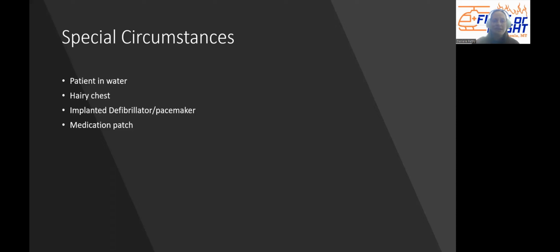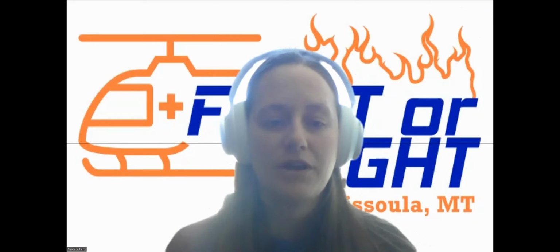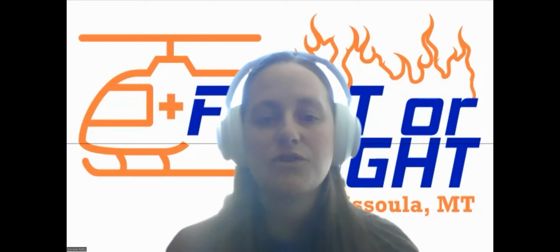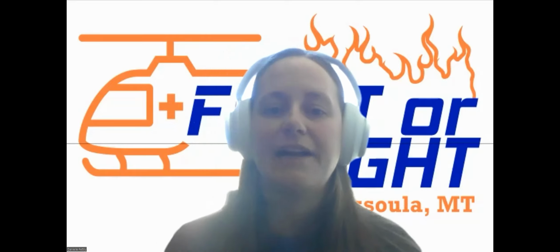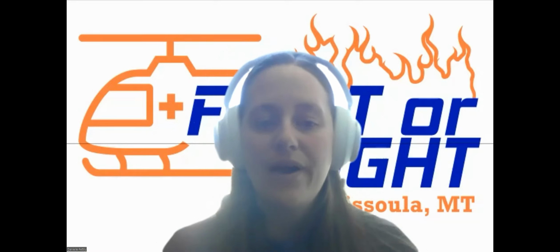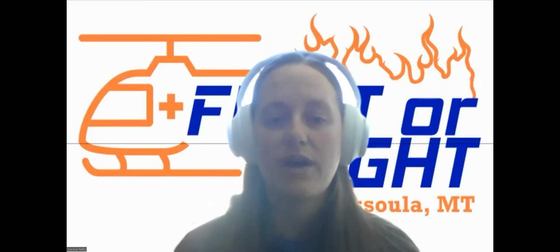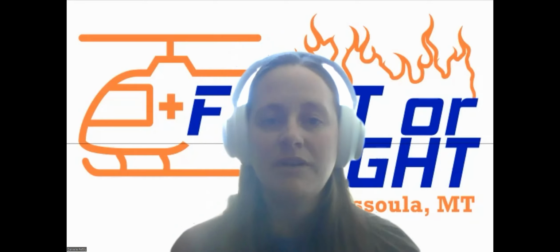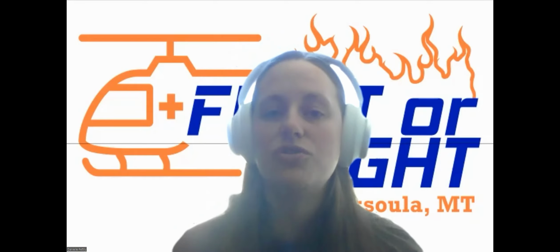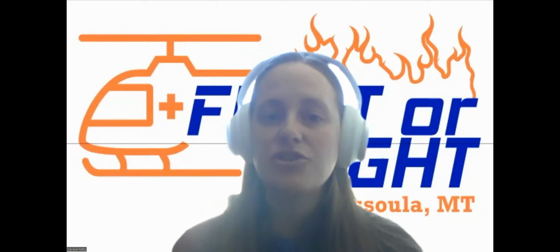Now, one last thing to think about with AED use is when you open up your kit, you should have pediatric pads as well as adult pads. I think it's pretty obvious you should use the adult pads on an adult and the pediatric pads on a child or infant. However, if you open up your kit and you have the wrong size pads, there's one way that's okay to switch and one way that's not okay to switch. And when I ask people to make a guess, they almost always guess this incorrectly. So the common guess is that it's okay to use the pediatric pads on an adult, right? That's a common guess, and that's actually incorrect.